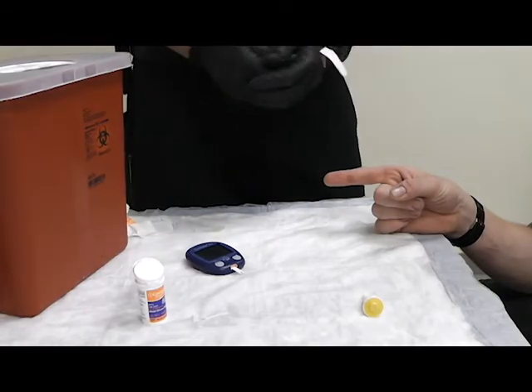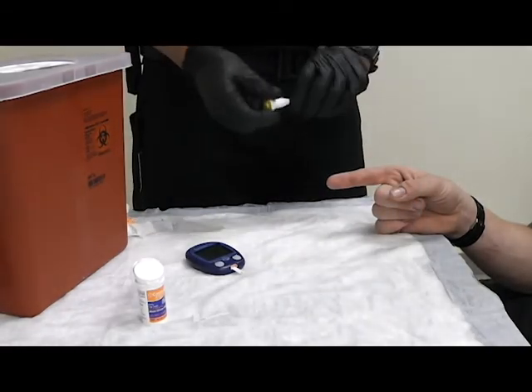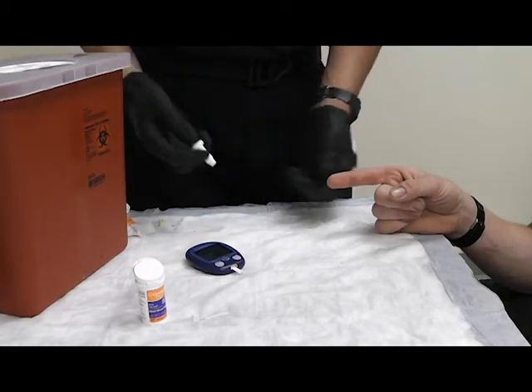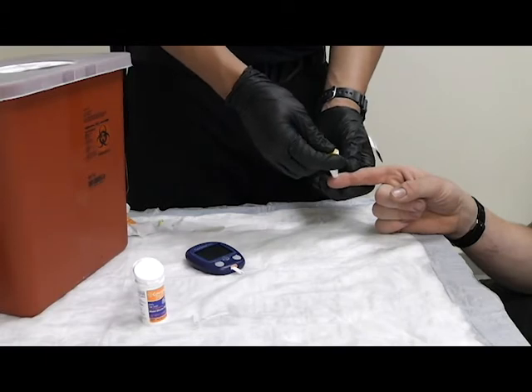I'm then going to let that dry. Once that is dry, I'm going to take my lancet, sharps out. I'm going to verbalize to the patient that I'm going to stick them on three. One, two, three.